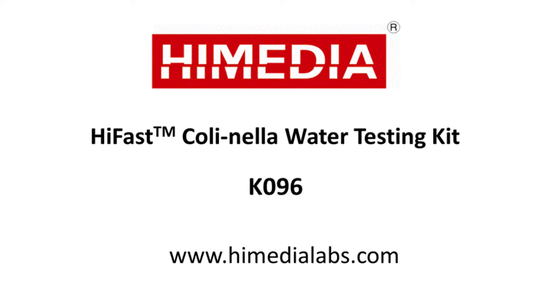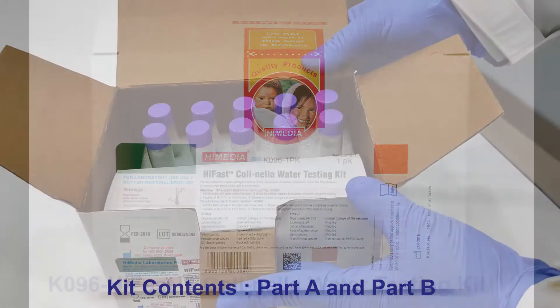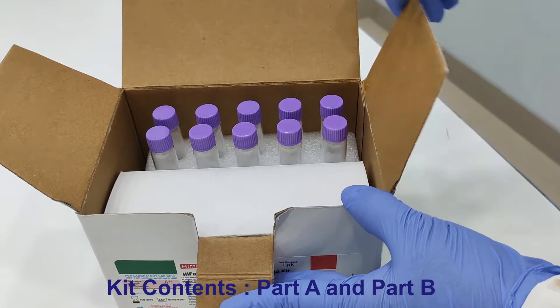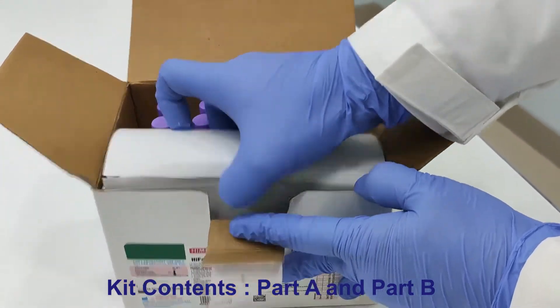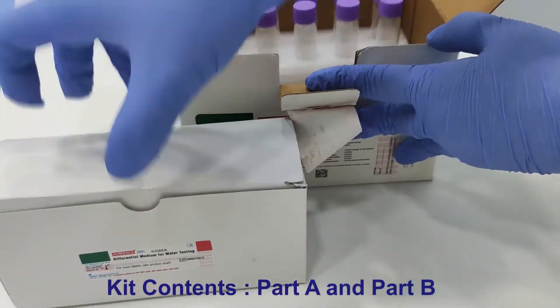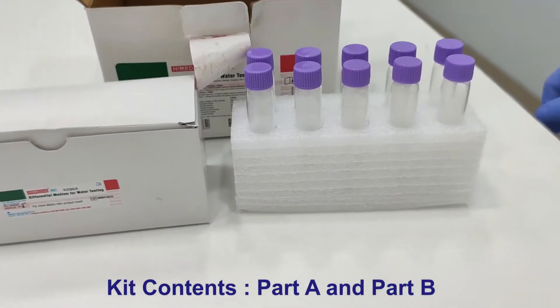This video demonstrates the K096 HiFast Coli-nella Water Testing Kit for rapid detection of E. coli and coliforms in water samples. This kit contains two parts: Part A for detection of coliform and Part B for detection of pseudomonas.